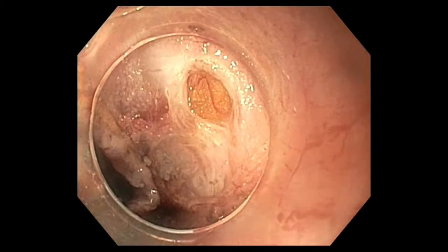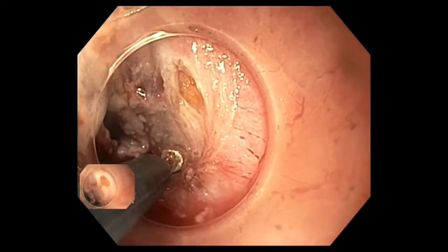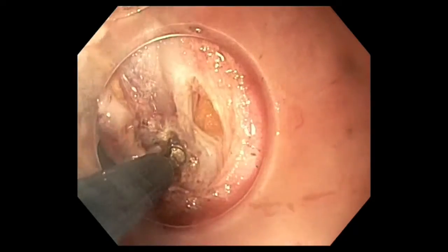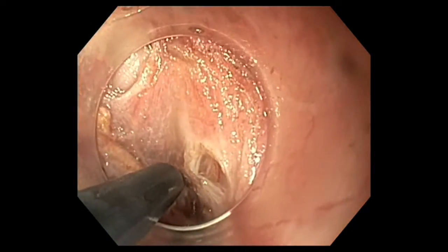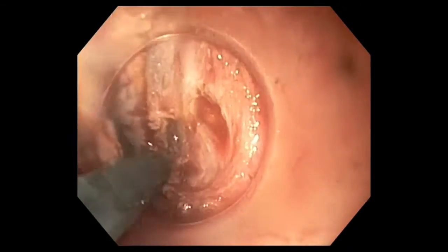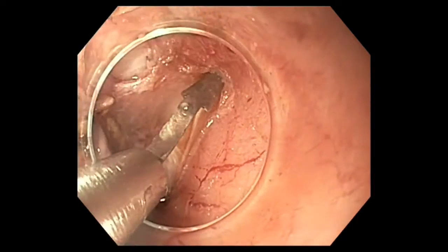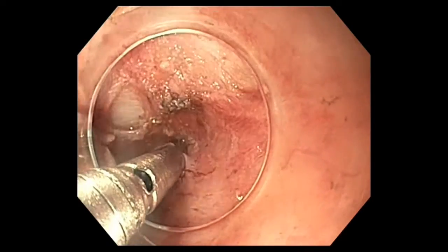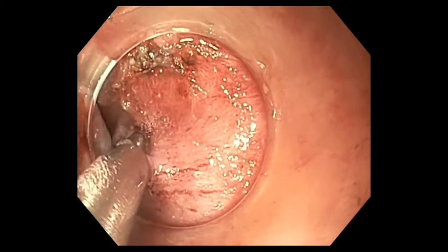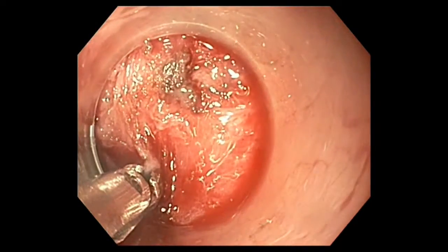In case of inadvertent perforation, the surrounding area has to be dissected prior to clip closure, because otherwise the clip will interfere with further dissection. However, in this particular highlight of the procedure, dissection of the area around the perforation was complicated by a major bleeding. Therefore, we gave priority to aspirating the liquids and closing the defect with a large clip. Then we identified the source of bleeding and coagulated the bleeding vessel.